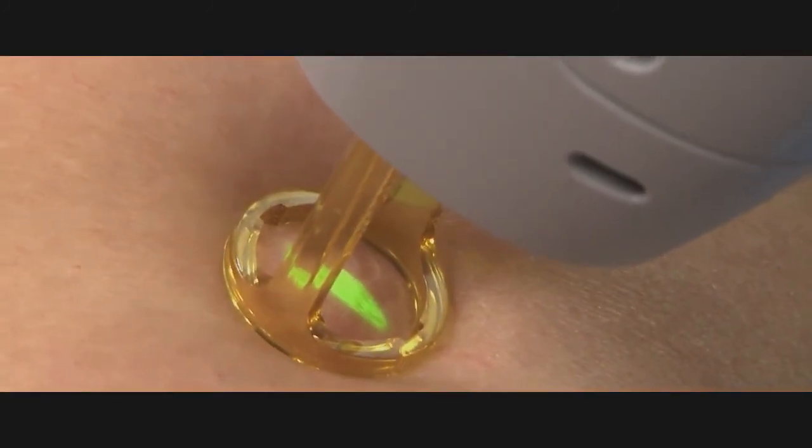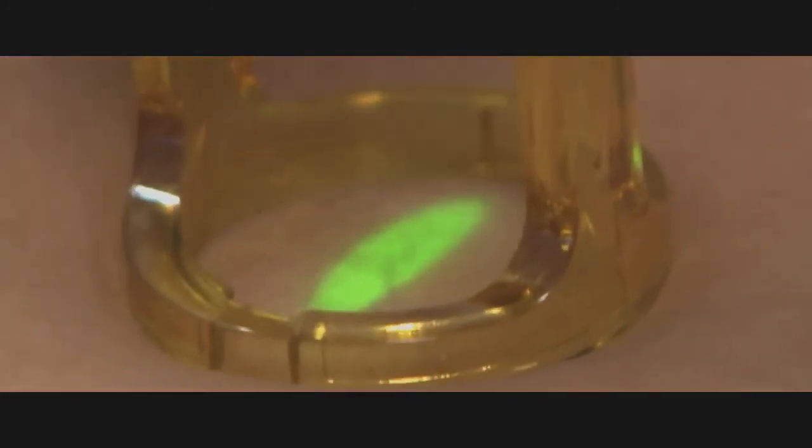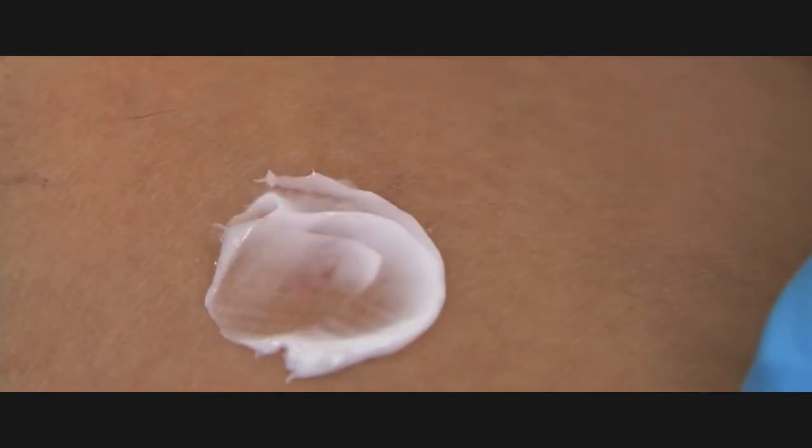The treatment endpoint is spasm and darkening of the vessel. It is also possible that the vessel will disappear momentarily. Once treatment is completed, follow the post-care instructions found in the clinical manual.